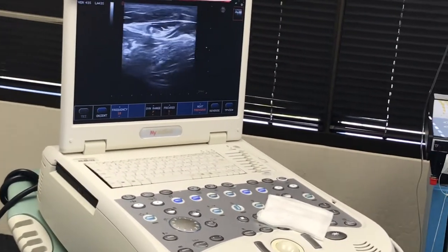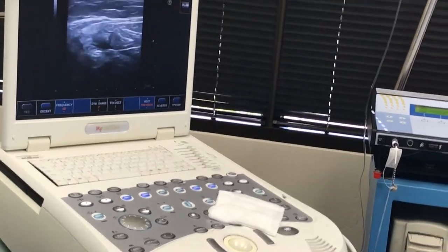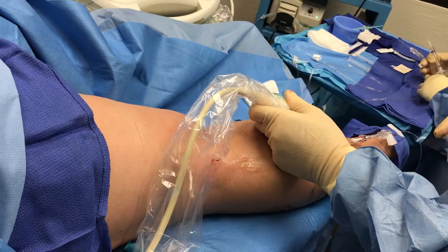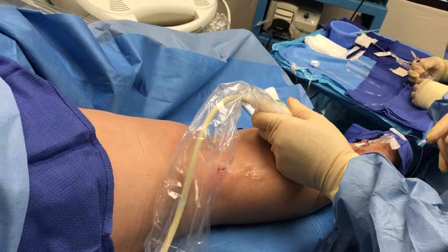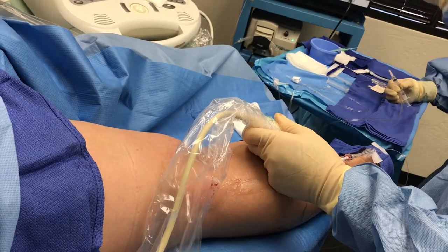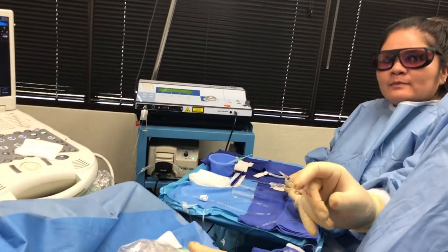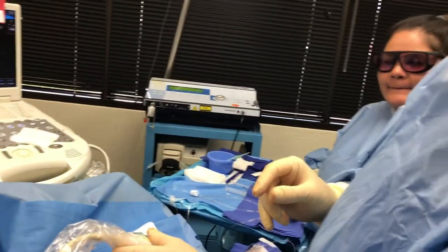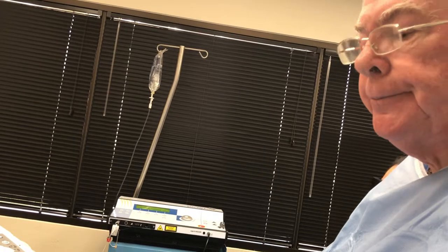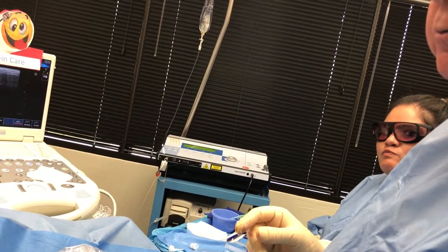One last look — okay, that looks alright. We'll put some glasses on so that we don't get any laser injury to the eyes. This laser light comes out at about 830 nanometers, which is just the right wavelength to give chronic exposure to people and cause cataracts, so we usually put these glasses on to help reduce that.